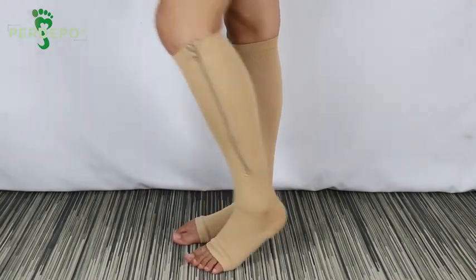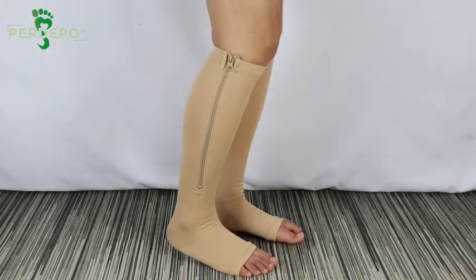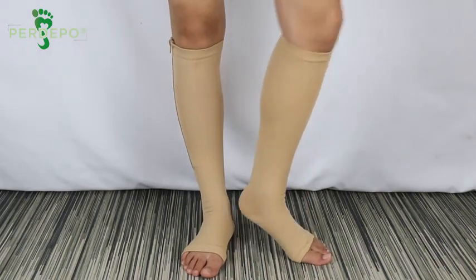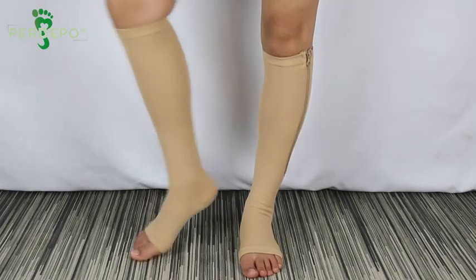As I'm sure you already know, compression socks provide pressure to encourage blood to flow upwards from your ankles through the deep veins in your legs to your heart.